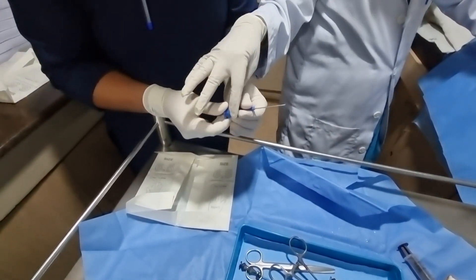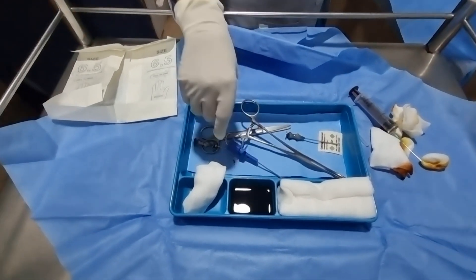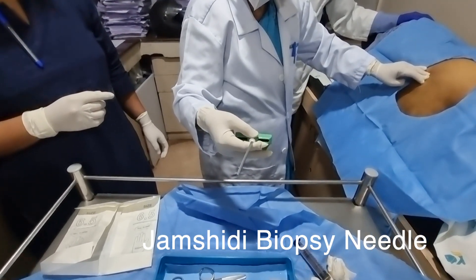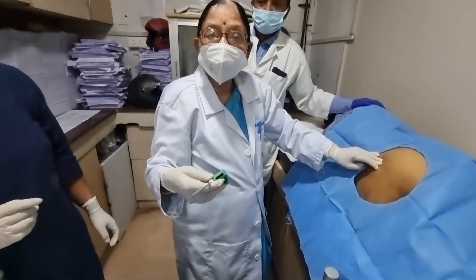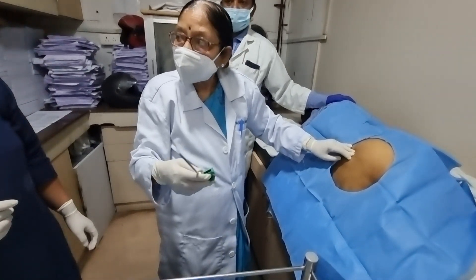This is the aspiration needle, and this is the Jamshidi needle for the bone marrow biopsy. The indication is usually all cases of lymphoma and leukemia suspected — we do the biopsy as well as the aspiration.